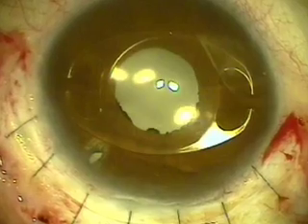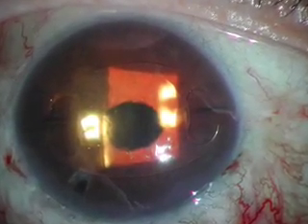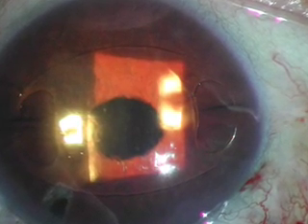An iris-fixated Artisan Aphakia lens — the patient postoperative at week one, seen here — with vision of 20/40 uncorrected. Thank you very much for watching this video.